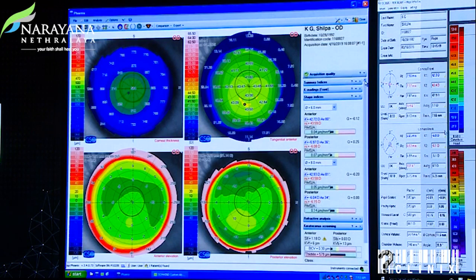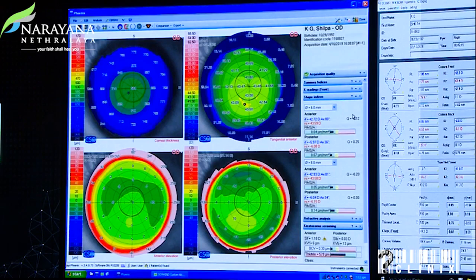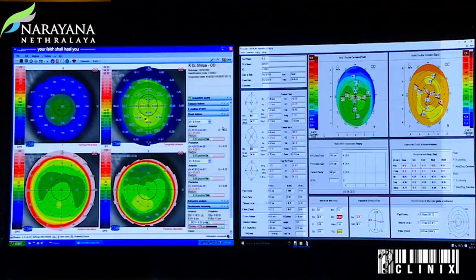Can you switch to the topometric keratoconus staging on the Pentacam? Notice the IHD is red and the TKC shows yellow — exactly as predicted. That's going to show an abnormality because it's based on the anterior surface and is essentially mimicking a Placido-based map, which has a very high false positive rate. From a shape analysis perspective, the cornea is actually normal — the indices are reflecting the displaced pattern, not true pathology.